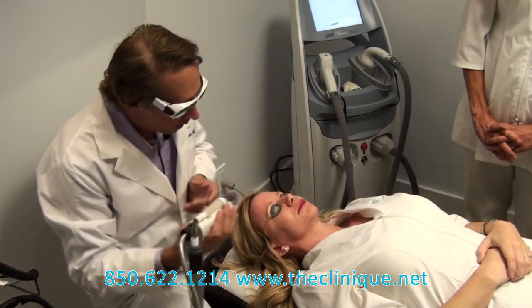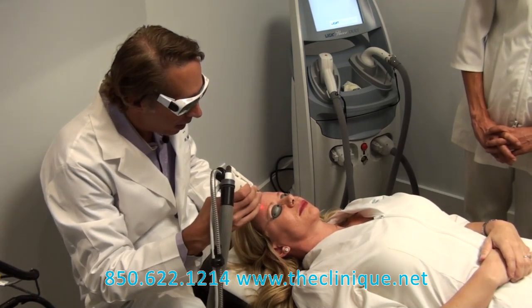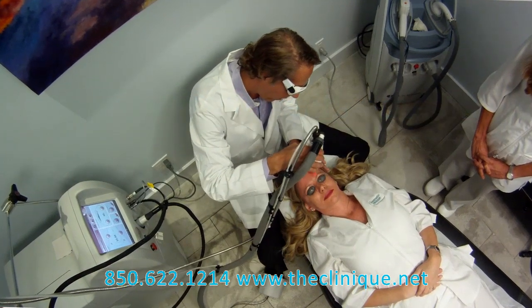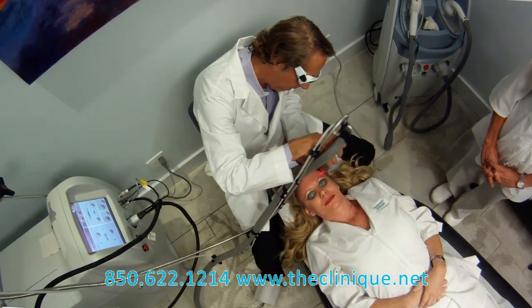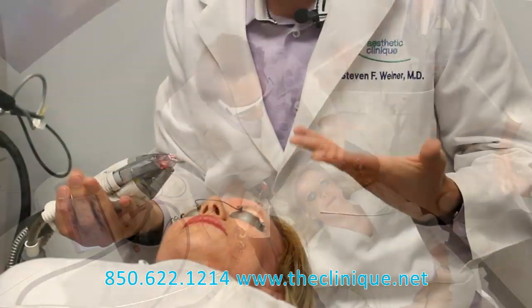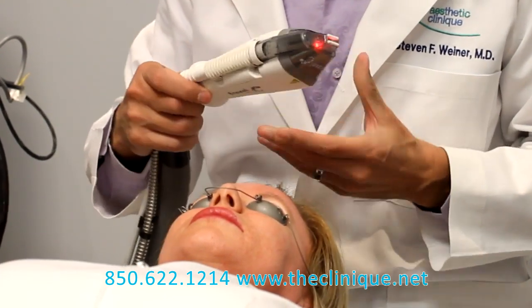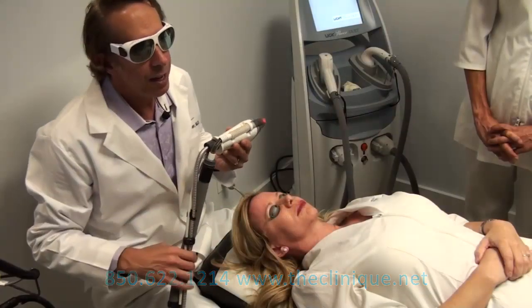It also has updated computer algorithms, so that where normally you would have to have four of these treatments, with this laser you only need three treatments. So it's more effective than the older Fraxel, as well as more comfortable because of the integrated cooling. And the combination of using the two lasers at the same time gives you a much better treatment than just the 1550, which is the older Fraxel Restore.